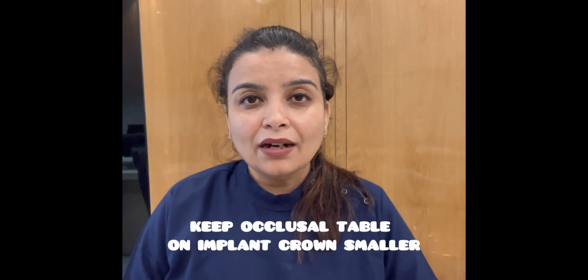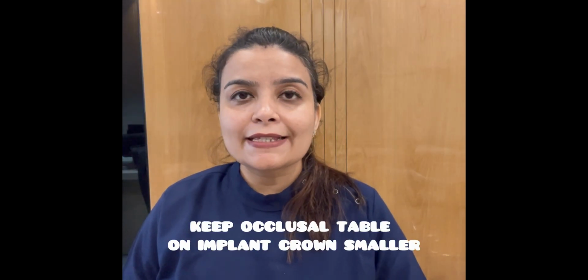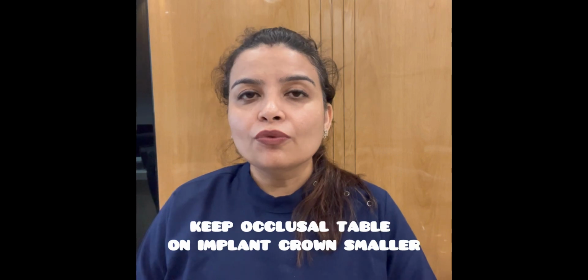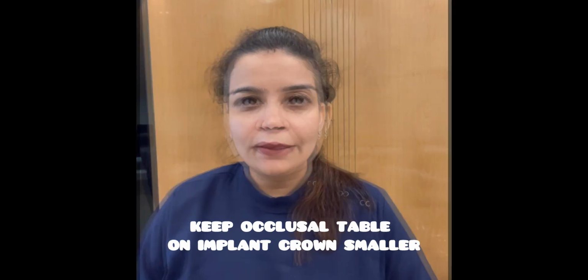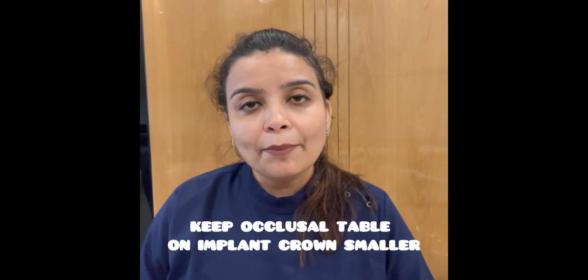When implants are splinted together, the primary contact has to be over the center of each implant and the secondary contacts can be in the zone between the implants as shown in the photo. The implant crowns should have an overall smaller occlusal table when not in aesthetic zone. A smaller occlusal table requires lesser force to accomplish the task of mastication as compared to a wider occlusal table. A wider occlusal table also acts as a horizontal cantilever, amplifying forces on the implant and bone system.